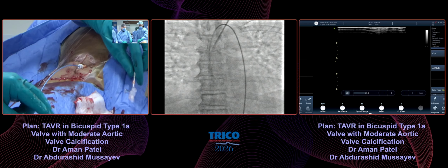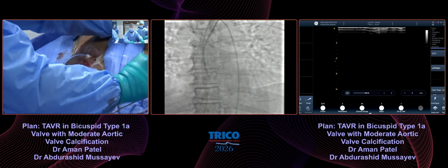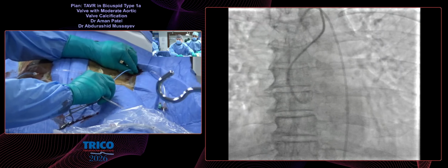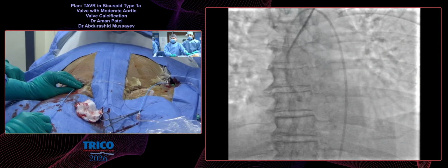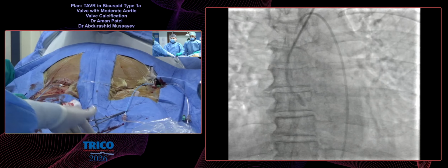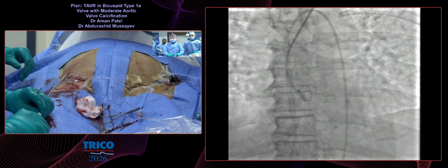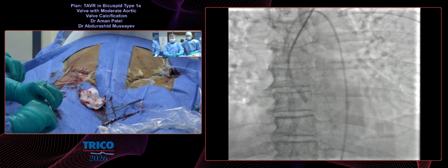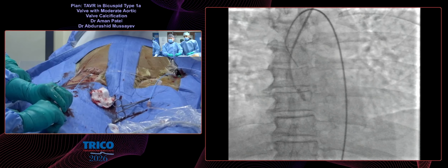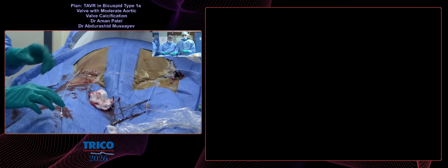We use two Percloses, just like you do. And one of the reasons we went away from the Angio-Seal is our vascular surgeons. They said, please don't use Angio-Seal, because when they have to cut down and go in, it's much more challenging for them to deal with an Angio-Seal problem. But I would say in the US, probably half the centers do this one-on-one, but we prefer the double.